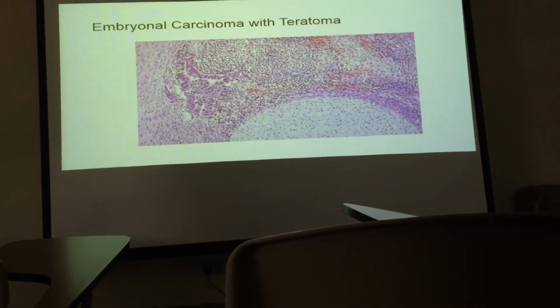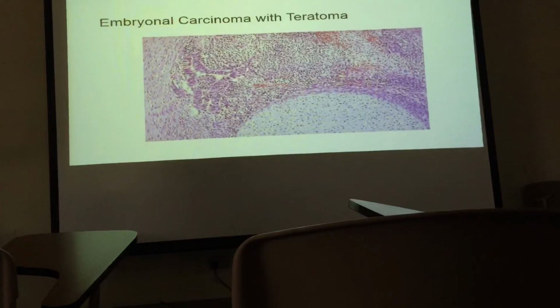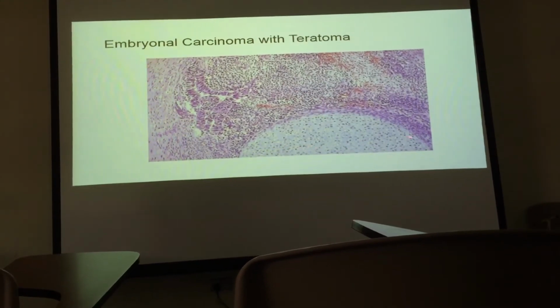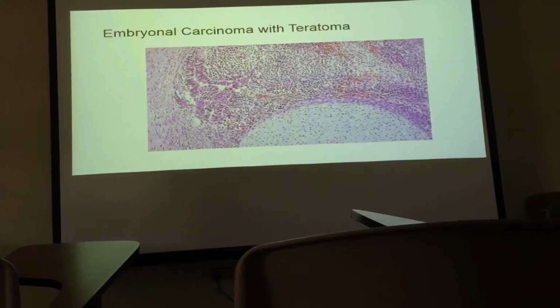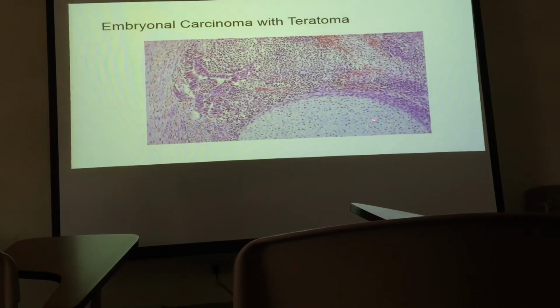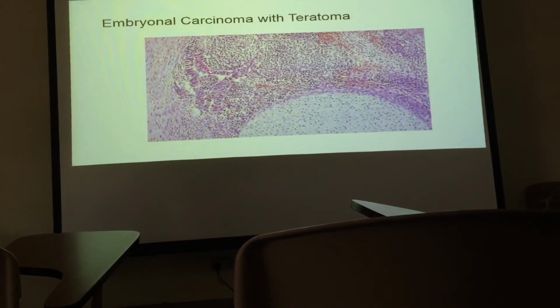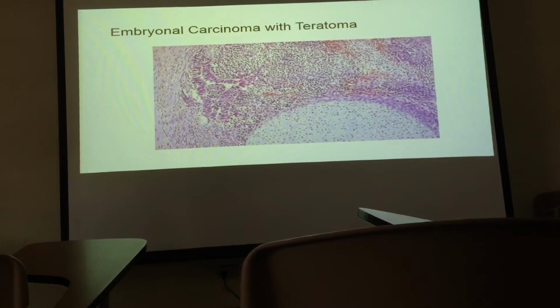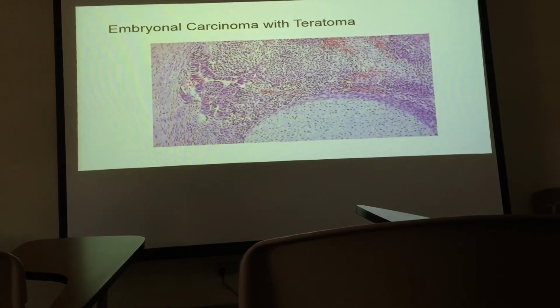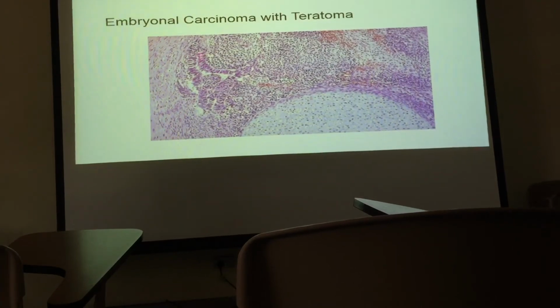Tissue. What is this structure? Cartilage? Yes, it's cartilage. This is cartilage. What are these structures? What do they look like? Muscles?